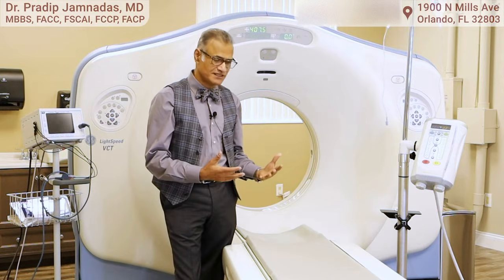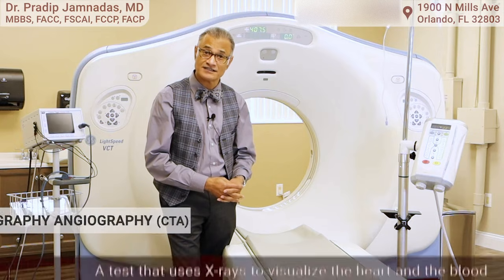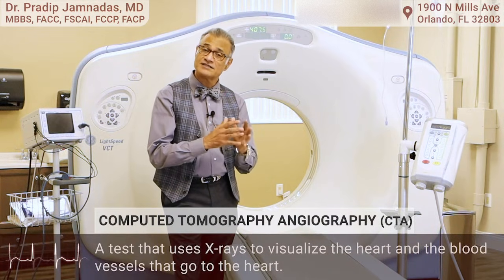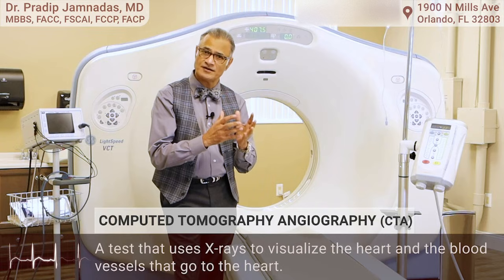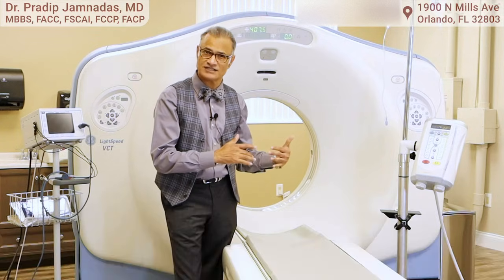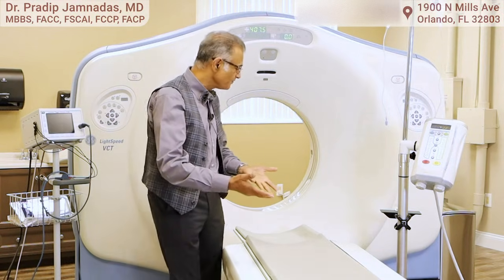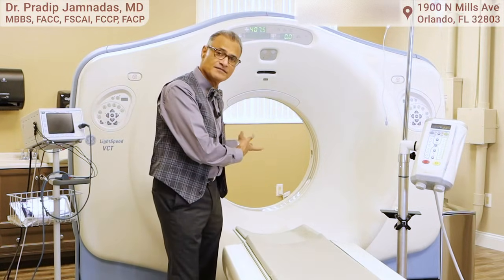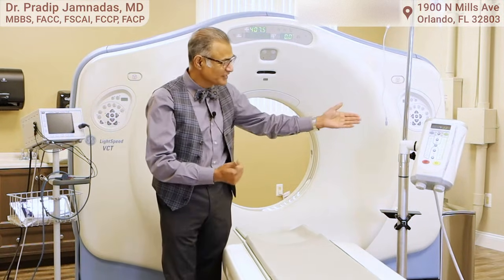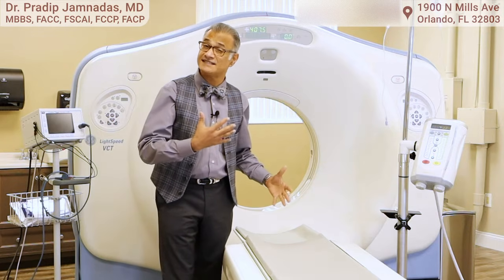The purpose of the CT scanner is to perform CT angiography of the heart. The heart is a moving object, and because it's a moving object, the CT scans are more technically challenging. This is a 64-slice CT scanner, and basically the patient lies down in here and goes through the scanner and out in a matter of minutes. We usually inject some contrast in an IV and do the CT scan of the heart.